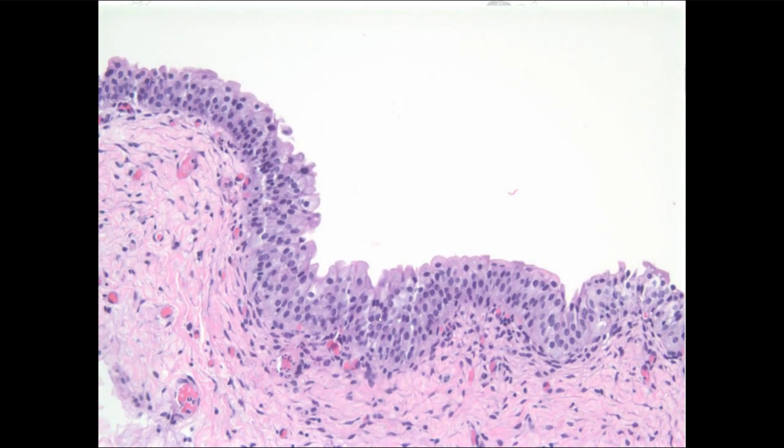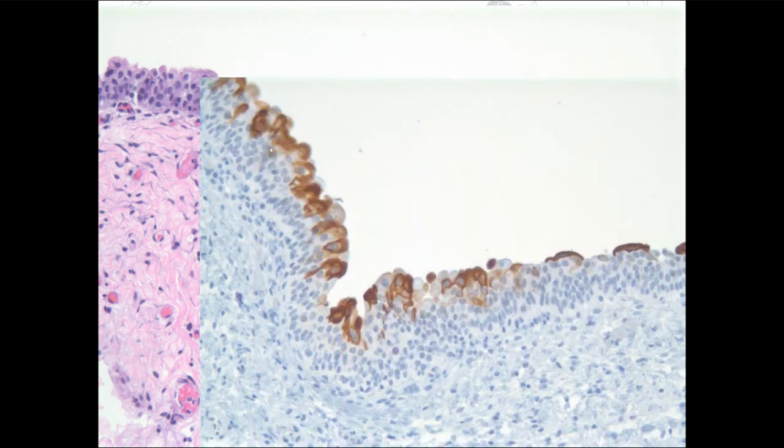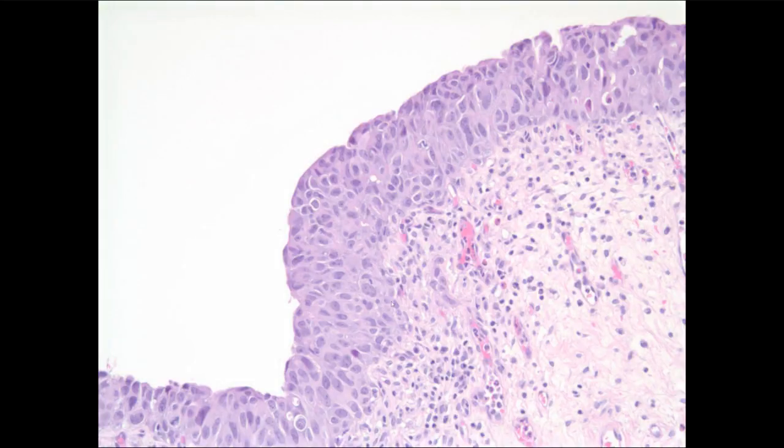So if you look at this H&E slide, if you were my residents, I would ask you, what is this? Is it reactive? Is it cancer? And if you did a stain, you can see the majority of these umbrella cells are staining, but it's not a transurothelial staining pattern. So this is reactive.